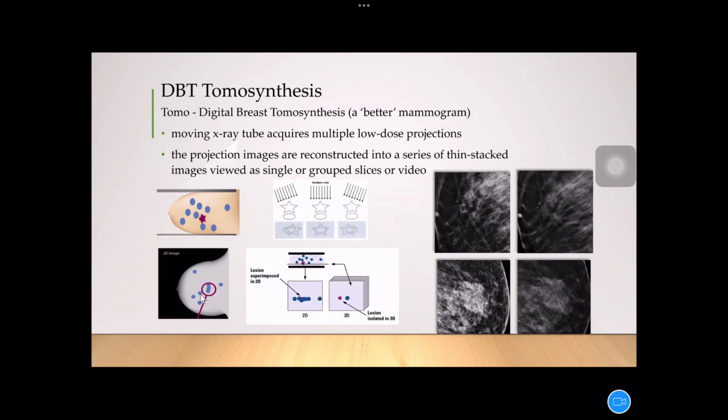So when we do the slices here, what we're able to do is slice through the breast after we've taken these angled images and reconstructed them in a 3D format, and eventually we'll come to a slice where we can see the changes that will help us recognise that there's a cancer present. That's illustrated in these 2 examples.